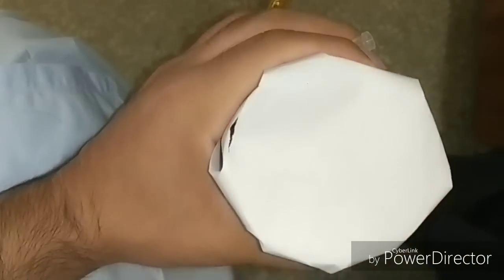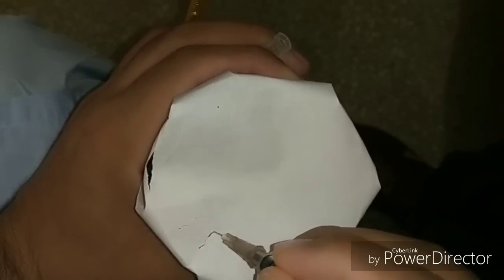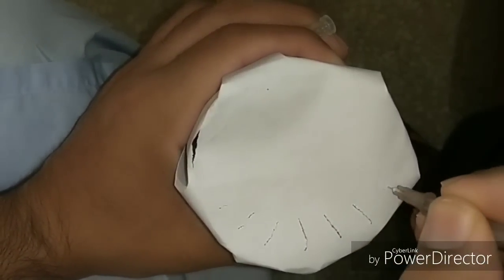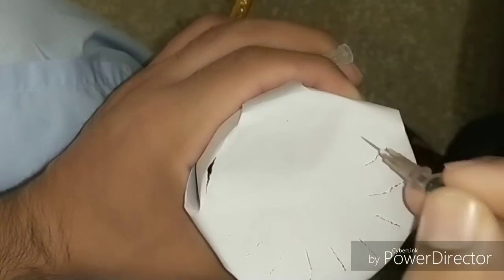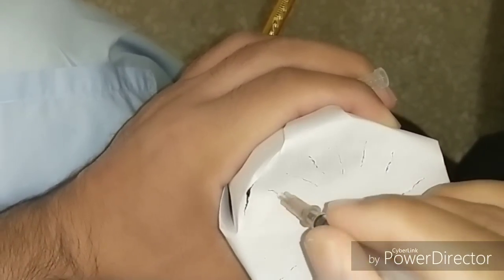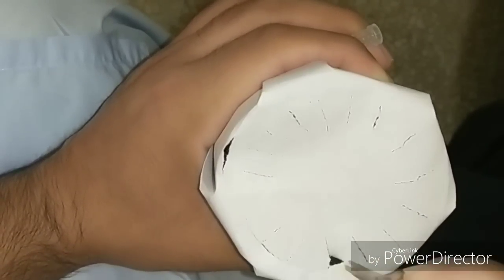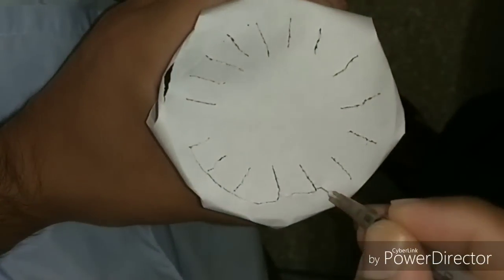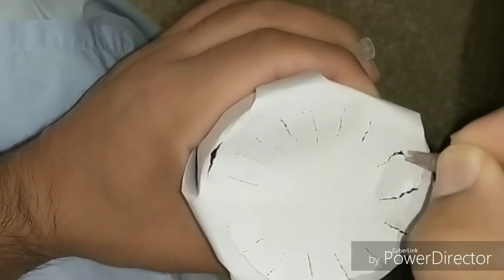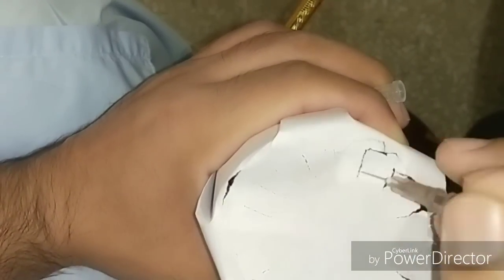In this video I would like to show you how to differentiate between capsulotomy and capsulorhexis. For this technique you need a 1cc needle, a piece of paper, and glass. Put the piece of paper on the glass and consider it the anterior capsule. You give vertical cuts into the anterior capsule and then connect each one — this is also known as the can-opener technique.